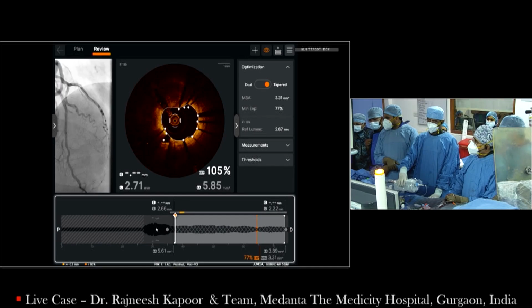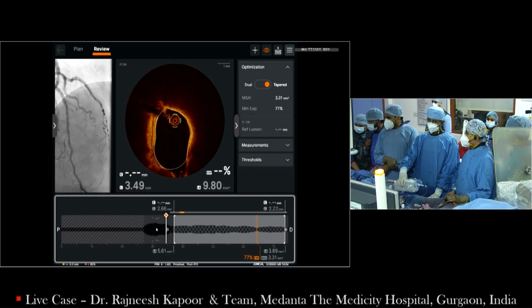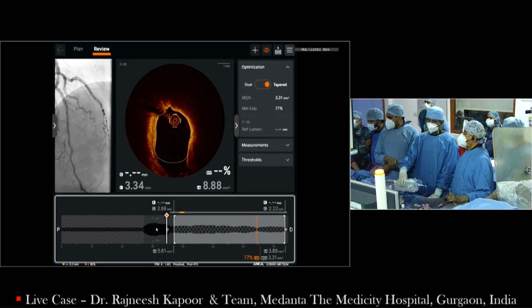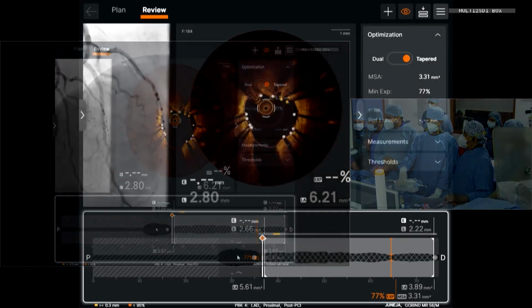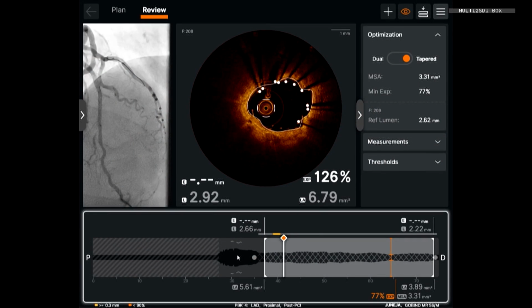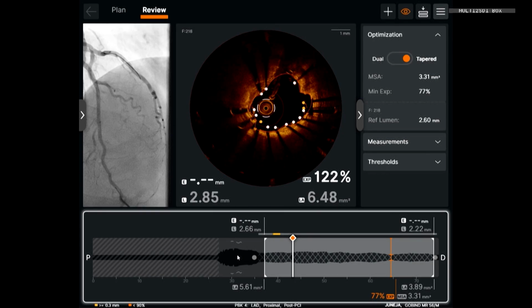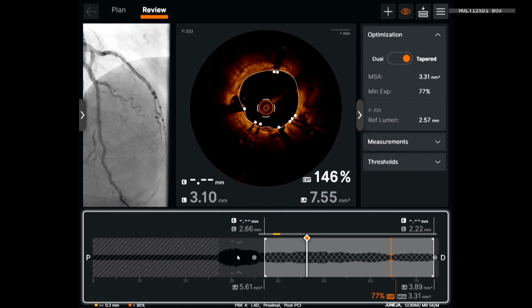Okay. Come again from the left main. So this is left main. There is circumflex ostium. Come back. Come into the LAD. So we are entering into the LAD, and here is the stent. Okay. Move. So this is all the stented segment in LAD now. The area is 6.9. Although we need to post dilate aggressively still.